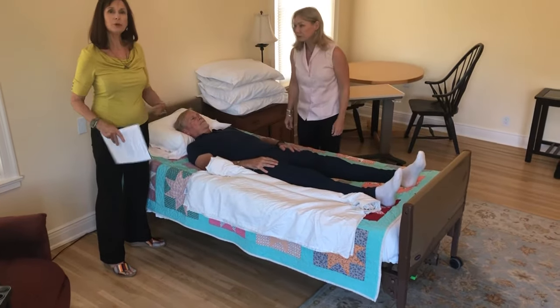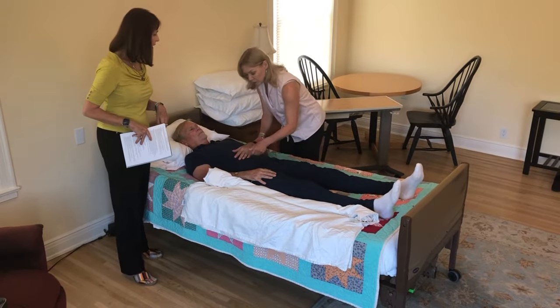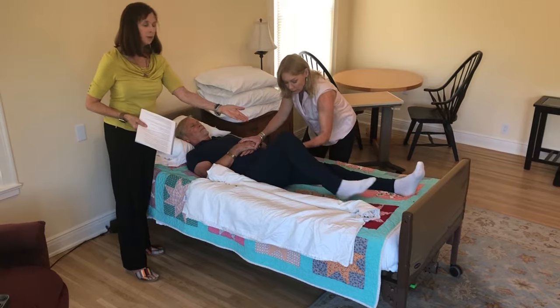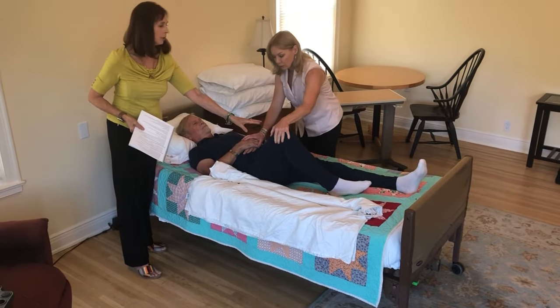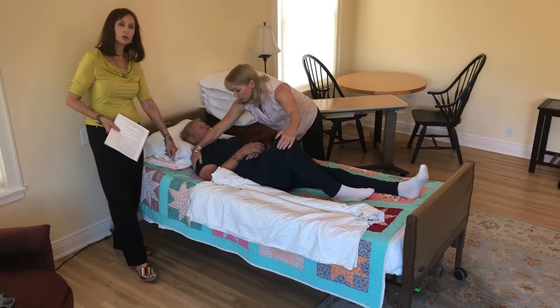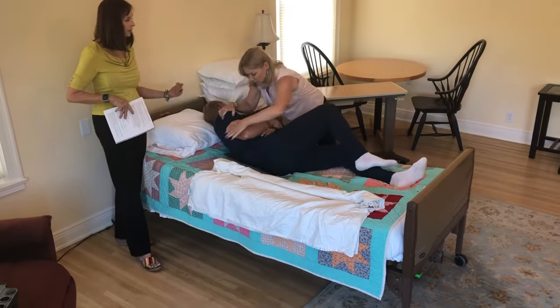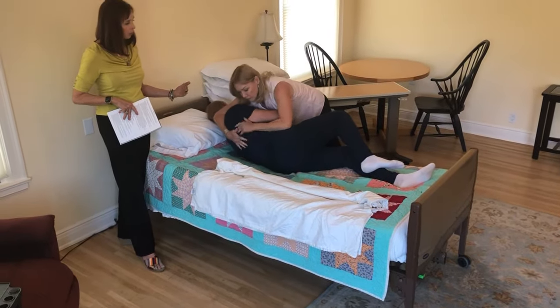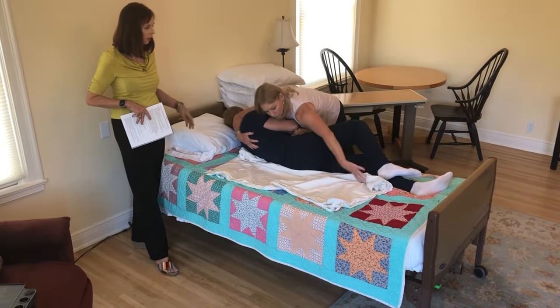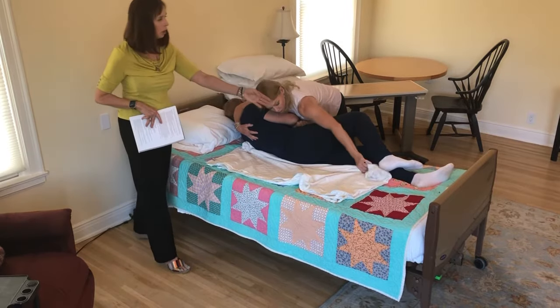Now, Brenda has to move Dan so she can get that sheet underneath him. First thing she's going to do is bring his hands on his chest so they're not interfering. Bend up the leg that's farthest from her, and she's going to use that as a leverage point along with her hand on his shoulder and use her muscles to bring him towards her on his side. Notice how she supports his torso as she moves the sheet into place, tucking the rolled edge right under his torso from his shoulders all the way down.